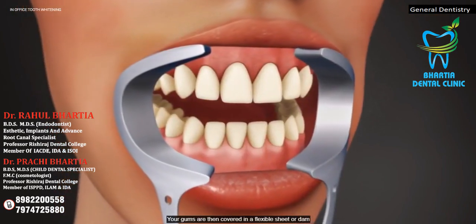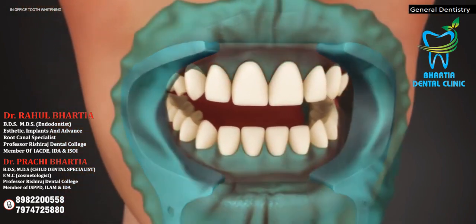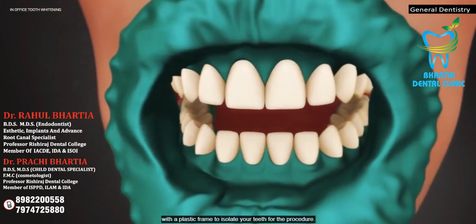Your gums are then covered in a flexible sheet or dam with a plastic frame to isolate your teeth for the procedure.